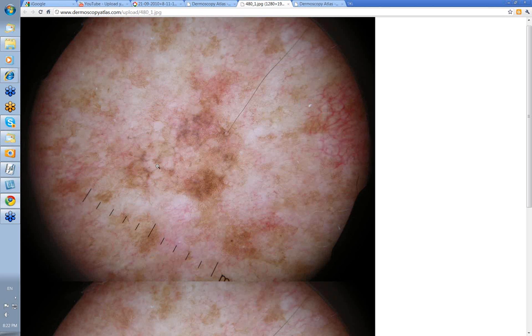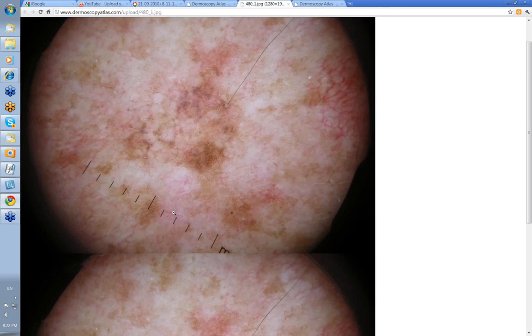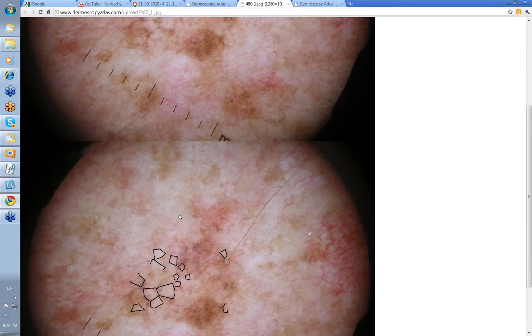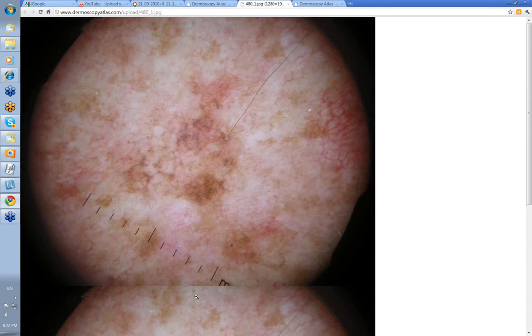These are Jeff's polygons. You can see these gray dots that often make up the outline of these and this is why we feel that they are in fact regression structures. This is where Jeff has drawn in these polygonal shapes. These are the polygons here, and these gray dots would also suggest regression within the lesion.